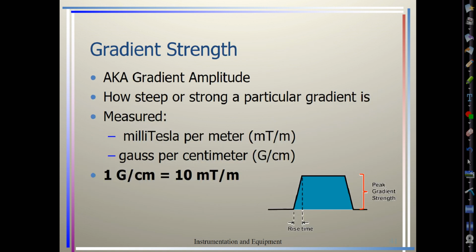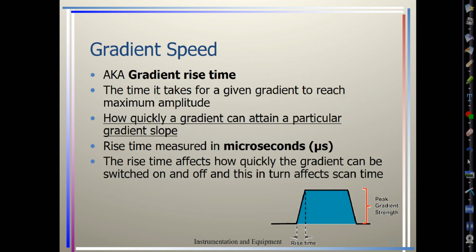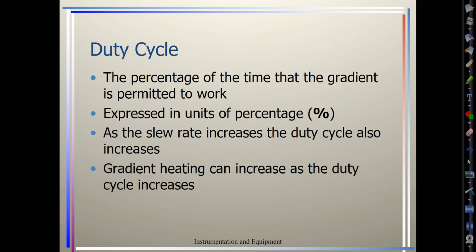And then we defined all 3 of these before. So our gradient strength, gradient speed, slew rate, and then our duty cycle.